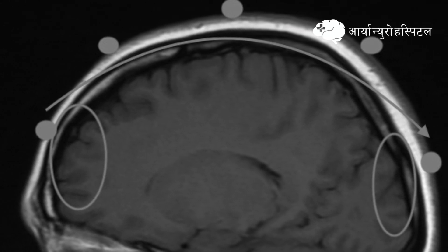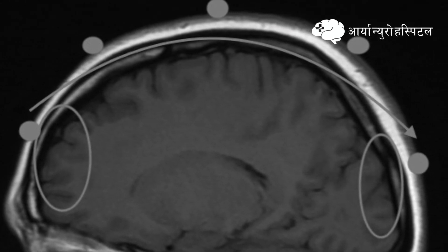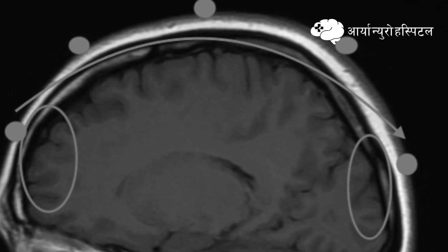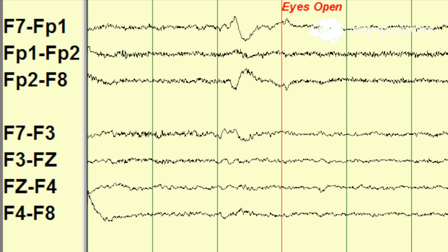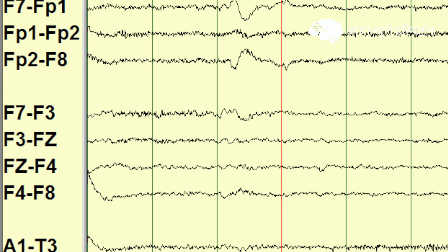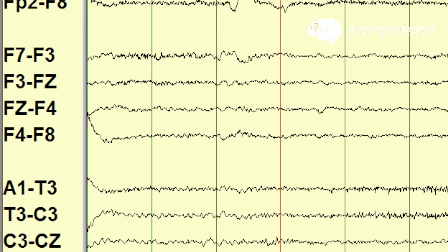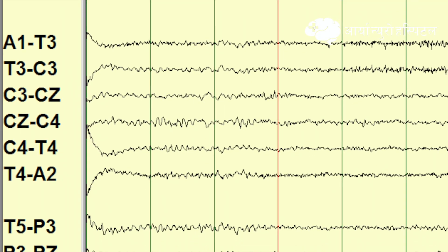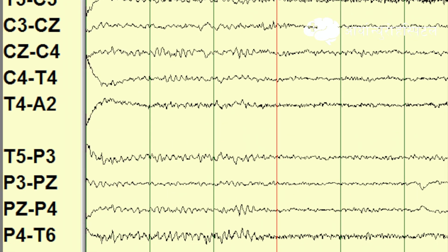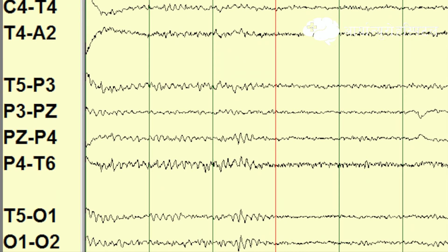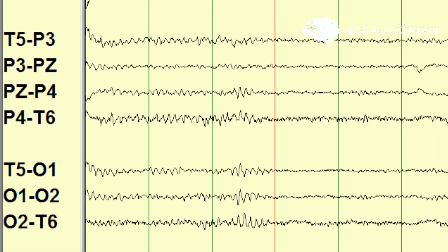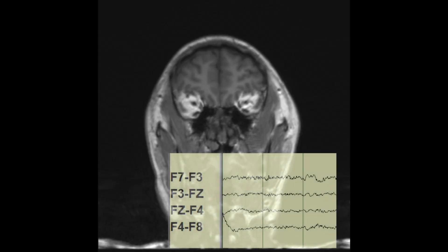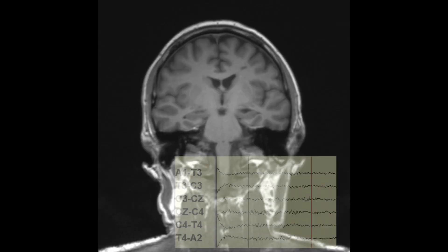In each sequence, the leads are arranged from the anterior (frontal) region to the posterior or occipital region. In transverse bipolar montage, we get the coronal functional images of the brain. In this transverse bipolar sequence, we get the frontal, temporal, parietal to occipital sequences.